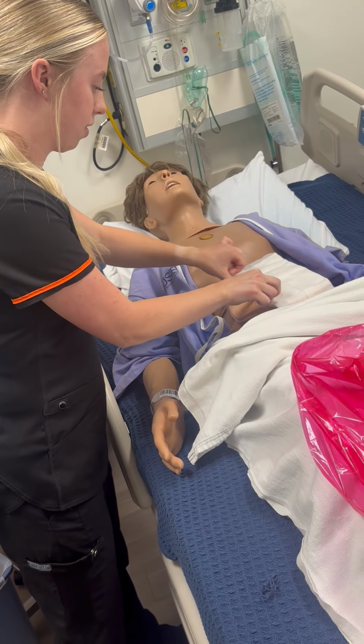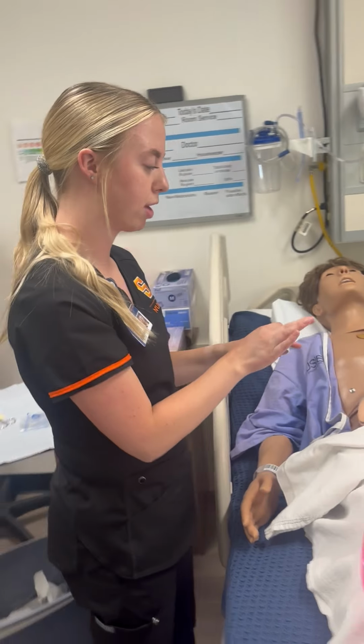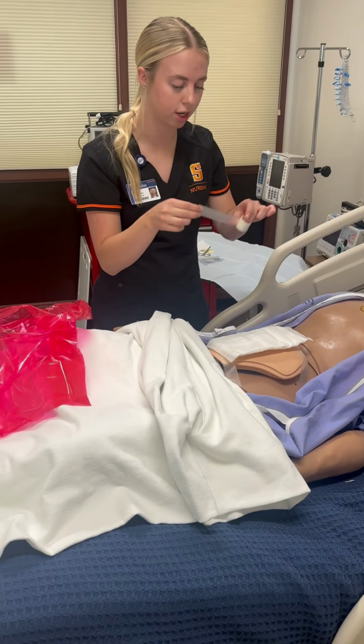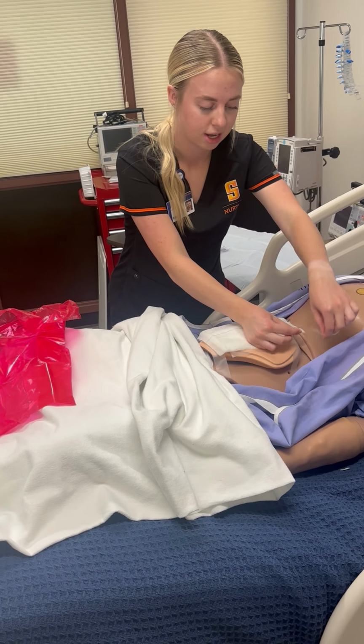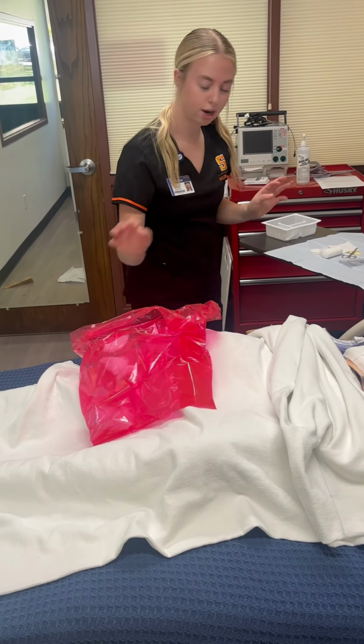Okay, we'll tape on the sides. With my patient's situation, I'm not gonna put tape on the top and the bottom, but in normal scenarios, I would for a patient. But I will tape down that other side just to make sure that it is nice and secure. Okay, that will go in there.